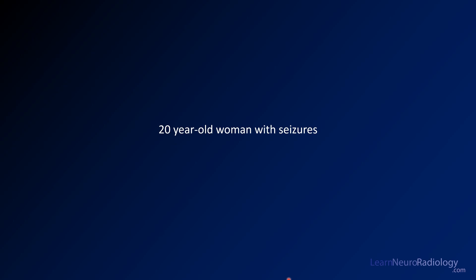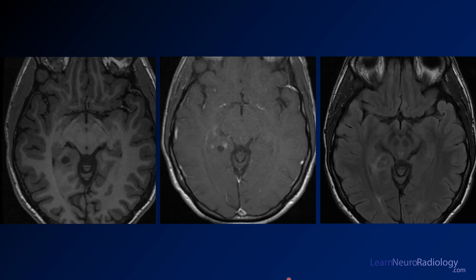Our next case is a 20-year-old woman with seizure — you see a developing trend; a lot of these patients have seizures. On the left, we have a pre-contrast T1-weighted image. In the posterior hippocampus and medial temporal lobe along the ventricle, you see a well-defined T1 hypointense lesion. On post-contrast imaging, there's not much enhancement in the cystic region, but some ill-defined enhancement and a few little patches of enhancement around it.